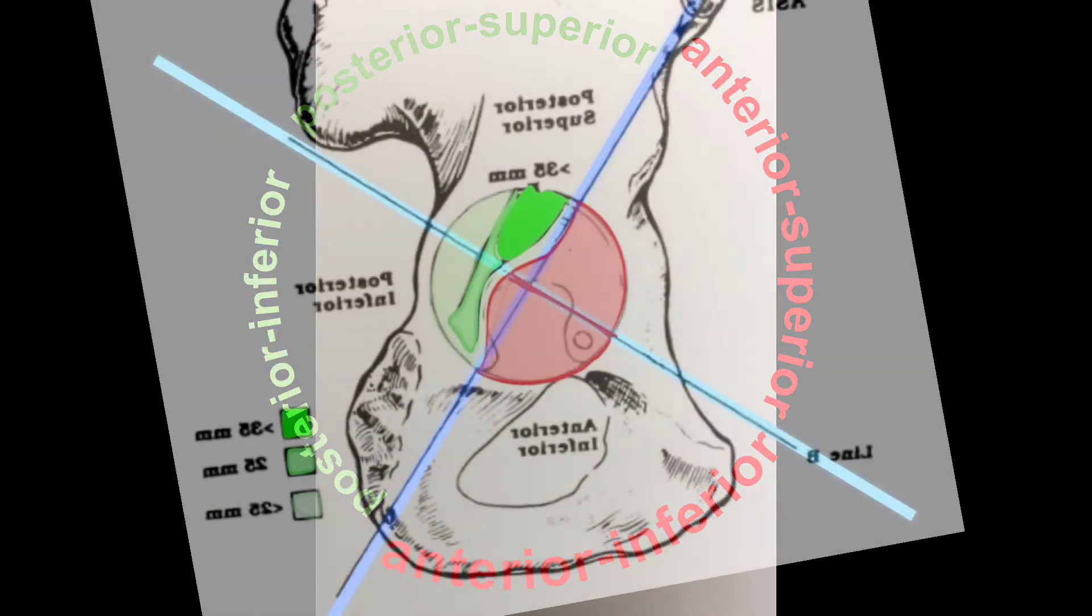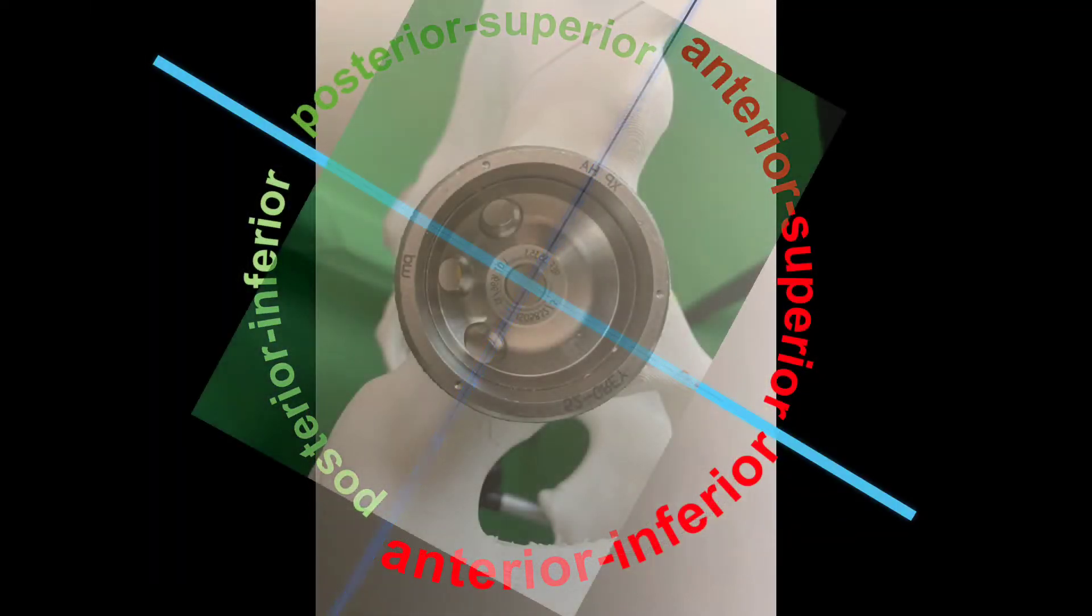When only one screw is used to anchor the cup, the surgeon can adjust the position of the required screw hole intraoperatively by rotating the cup to allow purchase into deeper bone stock and avoid injury to neurovascular structures.